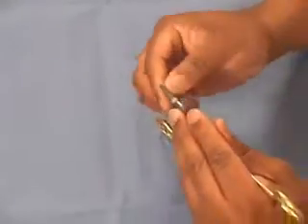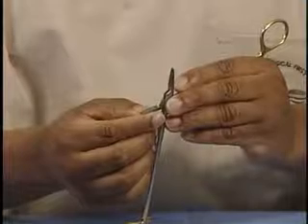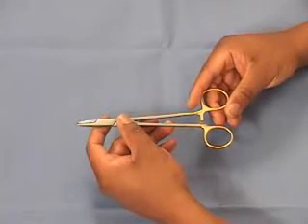If you look inside the jaws, you'll notice that there are serrations. This gives us better control over suture material and also various types of needles. Now let's look at the control methods for the needle holder.